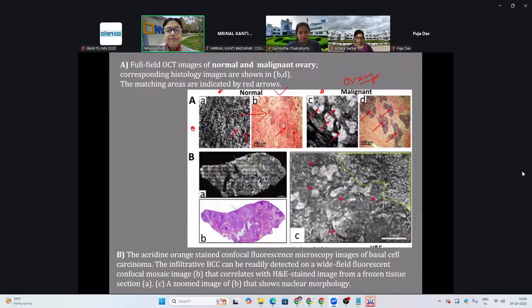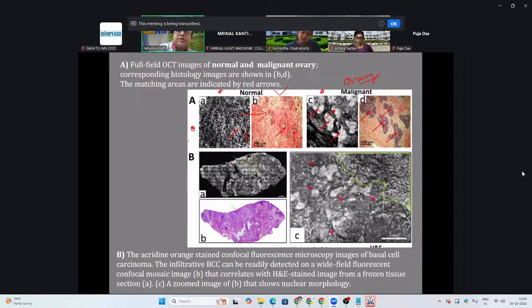From here, let's look at this. This is a digital kind of created image, the ANC. But when it was matched with histology and staining, which is B and D, it seemed that they matched up. And how?